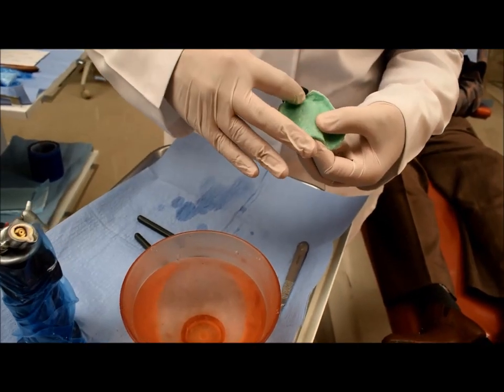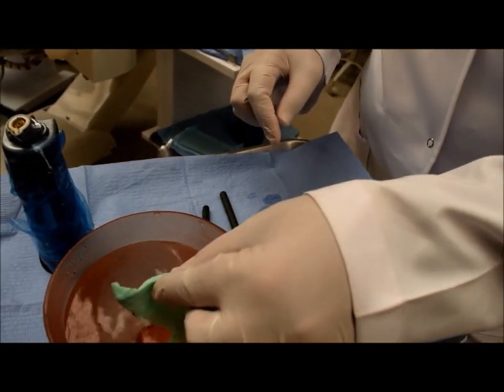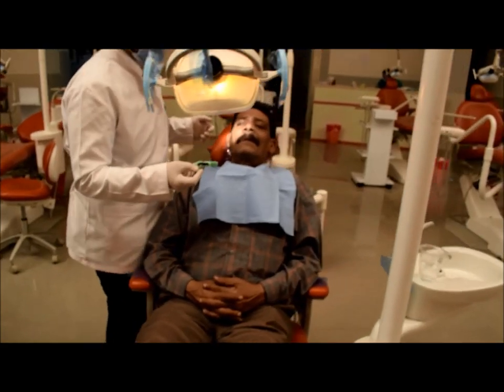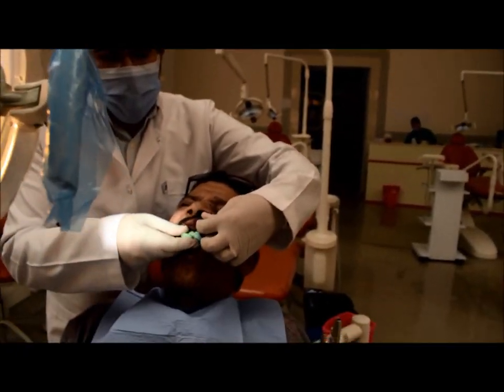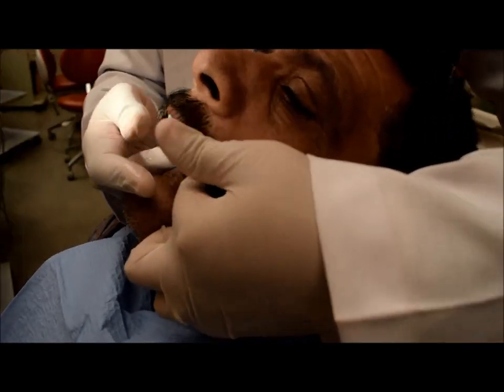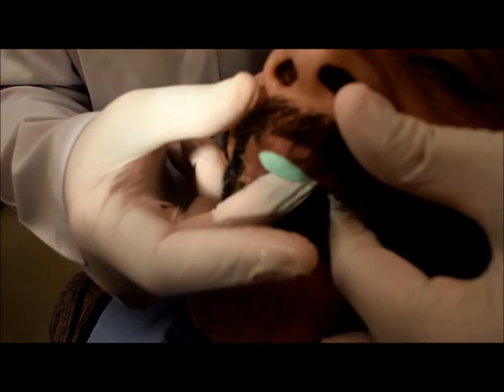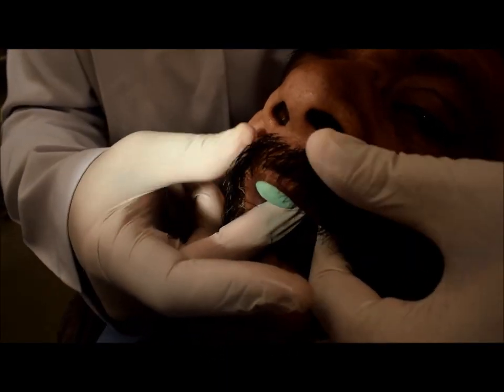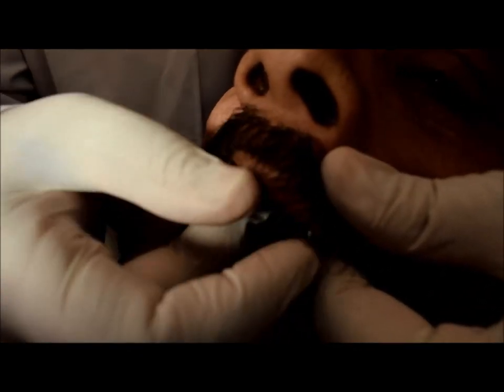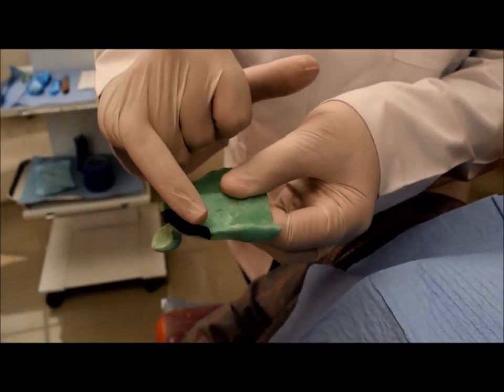The green stick is very sticky, so you should always be wetting your fingers and gloves, otherwise it will stick to your gloves. After adapting the green stick on the border of the tray, I go to the patient's mouth and start border molding. The movement is downward and inward — slowly, for the anterior part. I can work section by section. I remove the tray and check the border; it should be smooth and rounded.